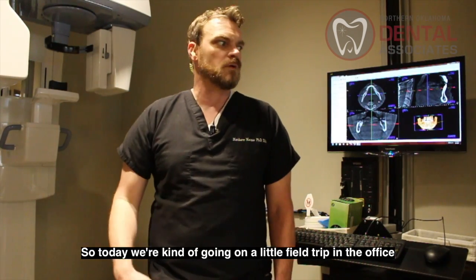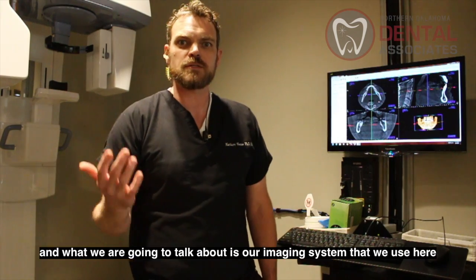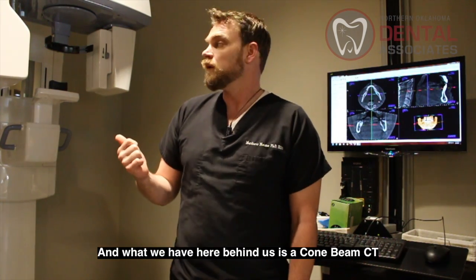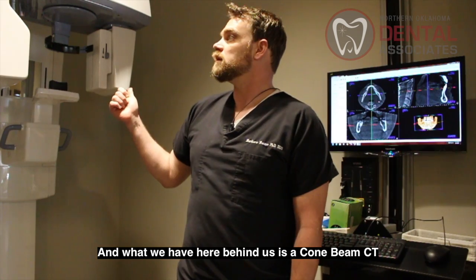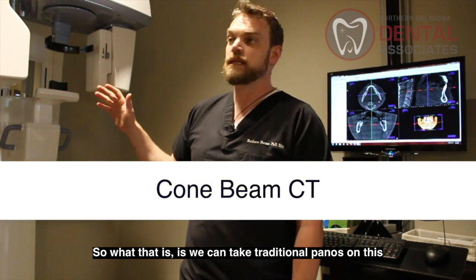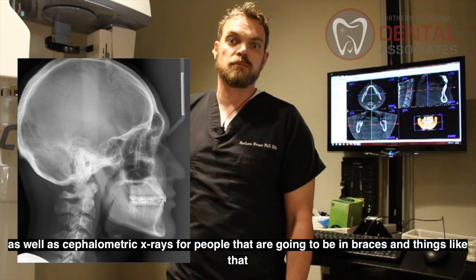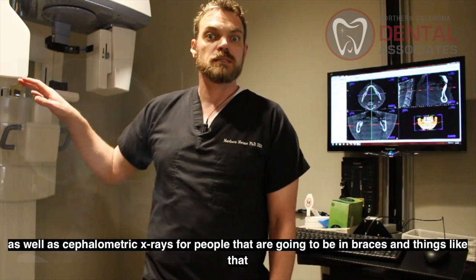Dr. Monty. So today we're kind of going on a little field trip in the office, and what we're going to talk about is our imaging system that we use here. What we have here behind us is a cone beam CT. So what that is, we can take traditional panos on this as well as cephalometric x-rays for people that are going to be in braces and things like that.